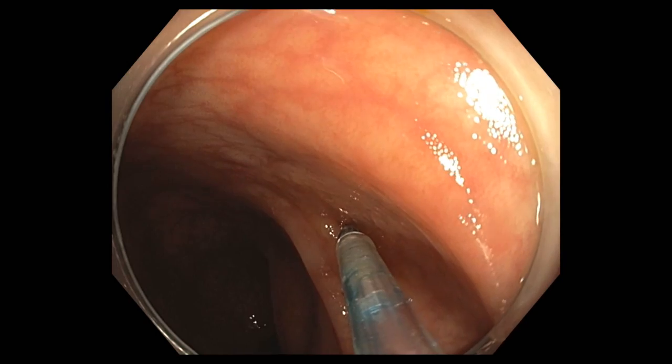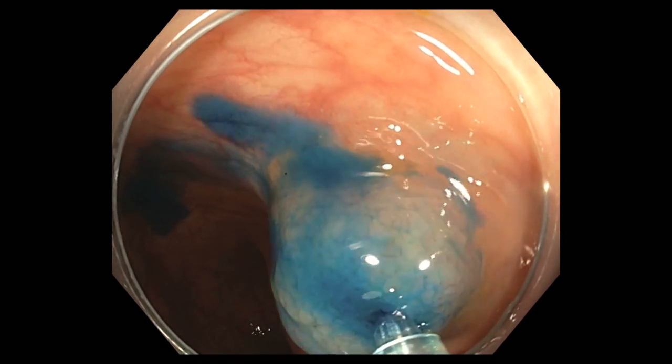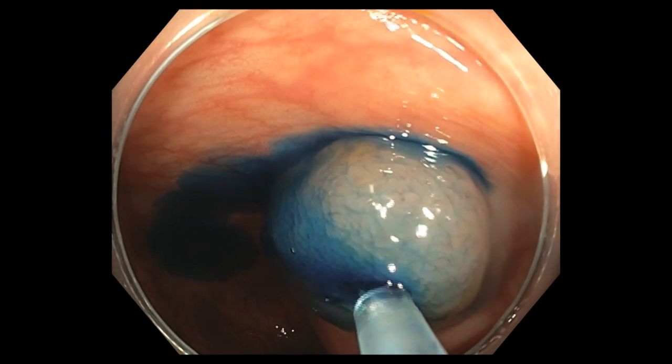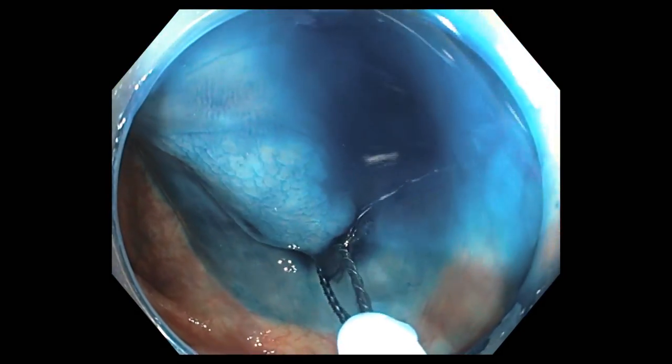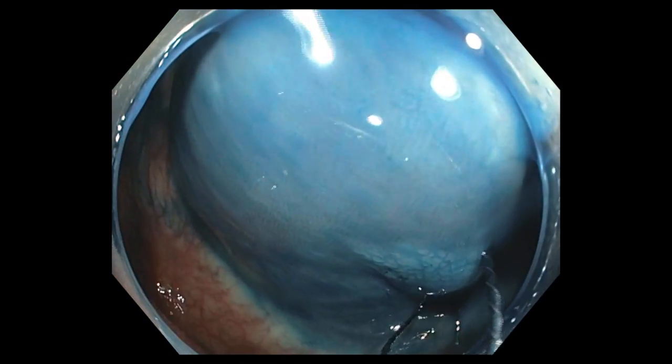Removal of these is best done by the standard method of endoscopic mucosal resection, where we inject a fluid or saline solution with a blue dye — in this case methylene blue — underneath the lesion. The blue dye allows us to clearly see the margins of the lesion and the associated normal mucosa.